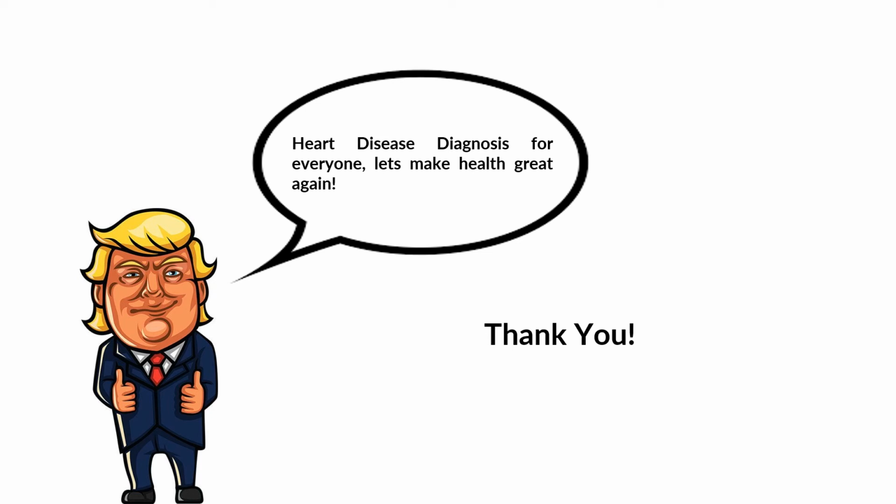To conclude, a device capable of phonocardiogram acquisition and classification has been developed, and I hope that this video enlightened you on the development of such a device. The device has an 86.61% true positive rate when tested on unseen data in a test set, and the simple hardware makes it mobile, cheap, and easy to construct, thus making it accessible to communities in need.